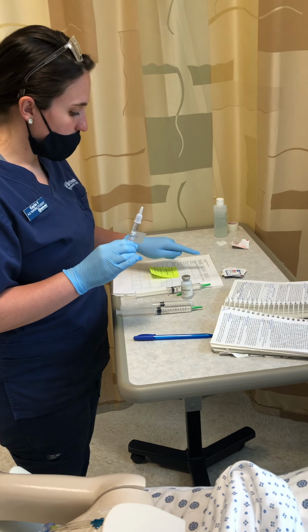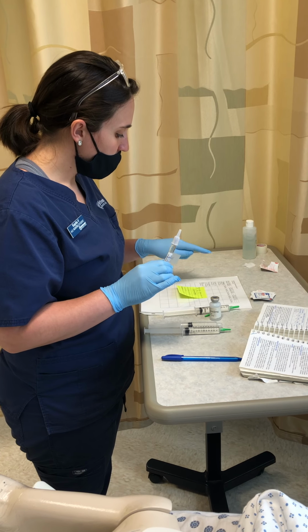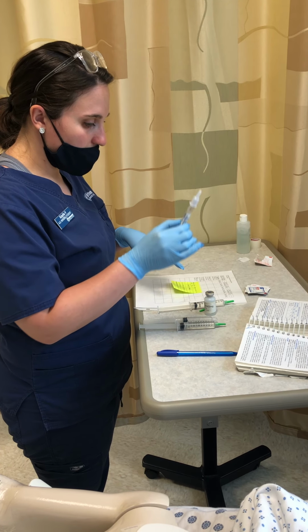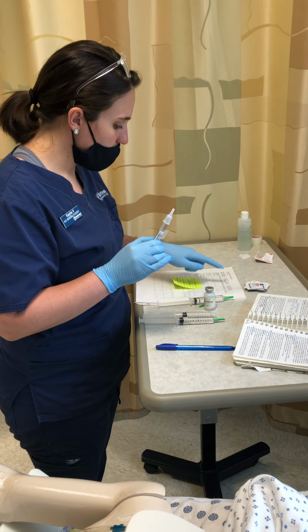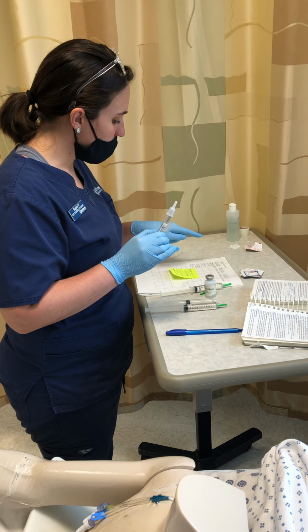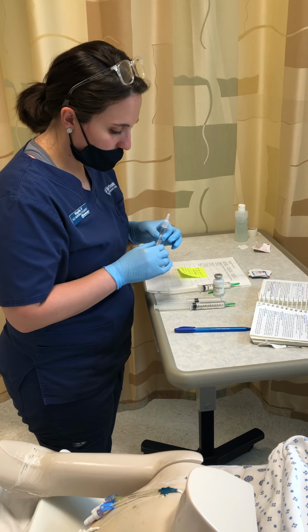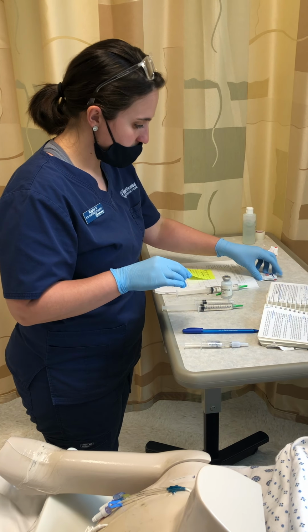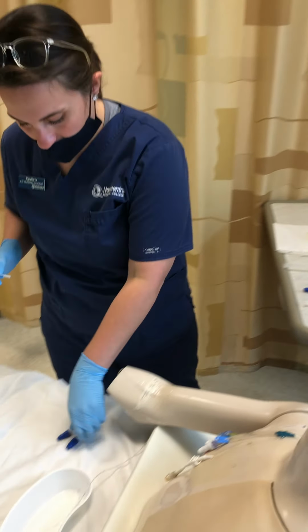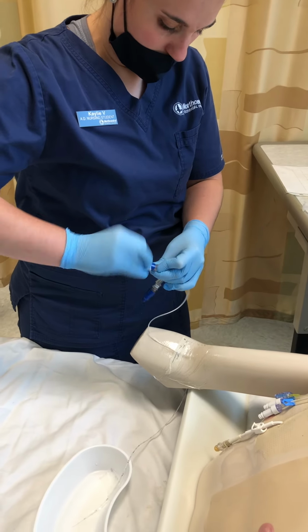Again, I have Bob Owens, 9/22/33, to receive lorazepam, 1 milligram IV push, due now, and that's what I have in this syringe right here. First thing I'm going to do is clean the port.